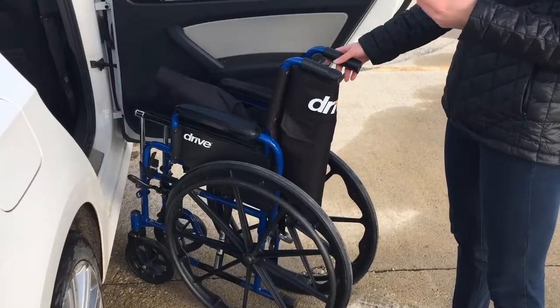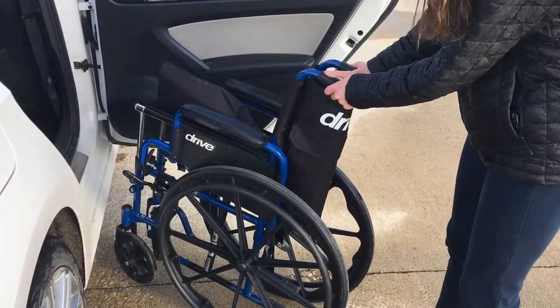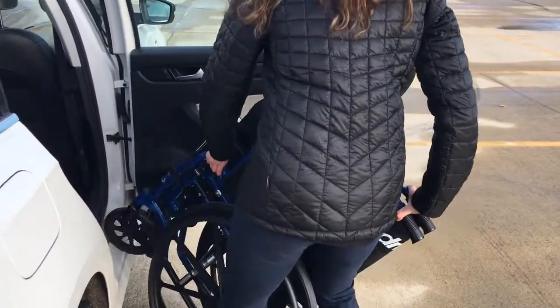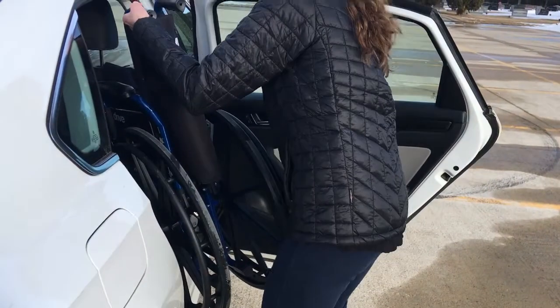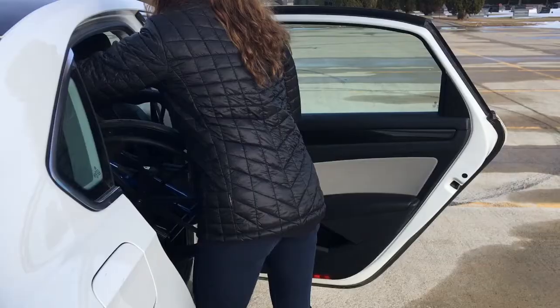You can grab wherever there is an anchored part of the wheelchair. You can tilt it back by grabbing onto the handles. Get the wheelchair a little bit closer, then tilt it up, grab the back of the wheel, and nicely slide it in.